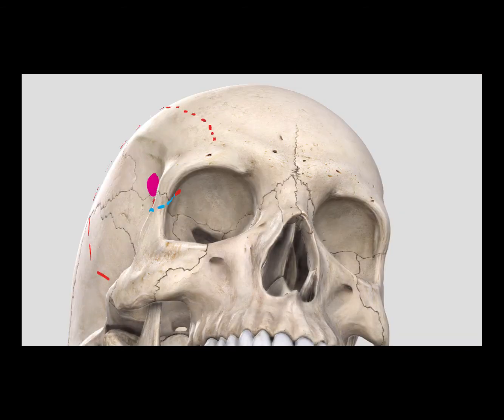The next step would be to use the oscillating saw to just weaken the superior orbital rim, connecting the end of your previous cranial cut. So you're going to just weaken it across the superior orbital rim.